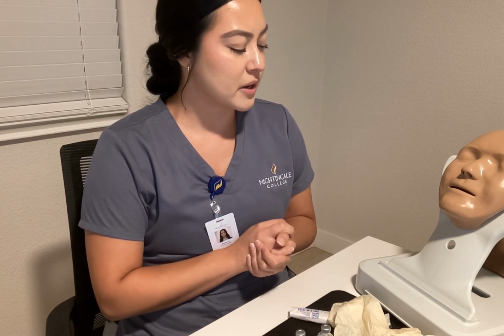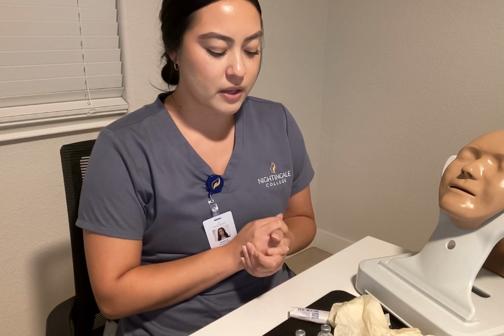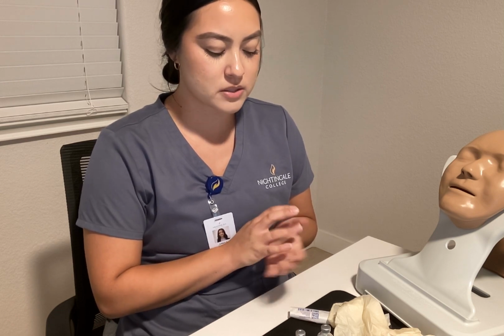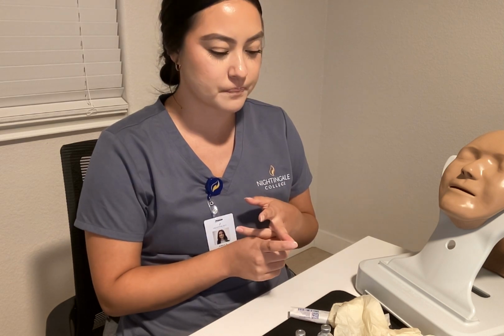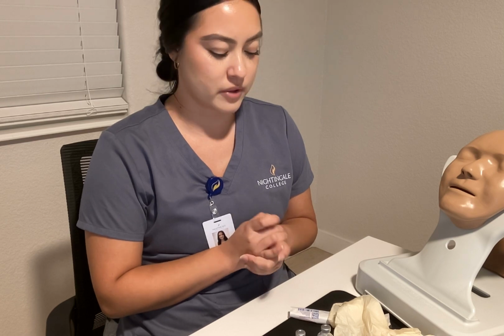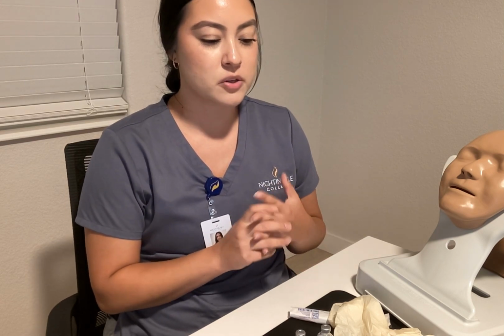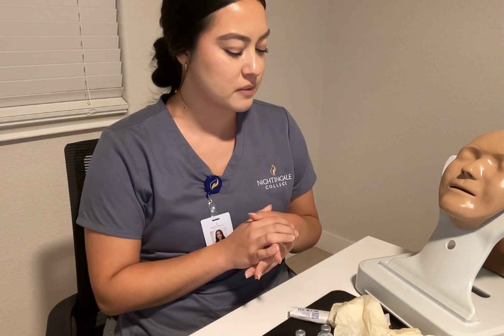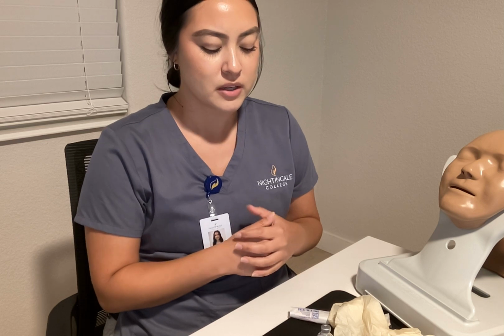Mr. Smith, today we're going to be going ahead and drawing up your insulin for you. We're going to be giving you some fast-acting insulin and some short-acting insulin for a total of 12 units that we'll be giving you about 30 minutes before breakfast. So for your regular insulin, excuse me, I'm trying to get over COVID.